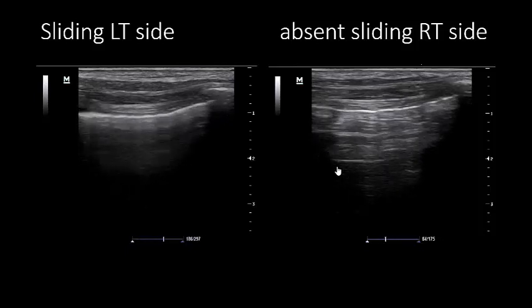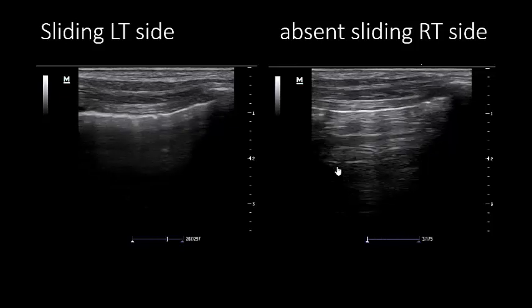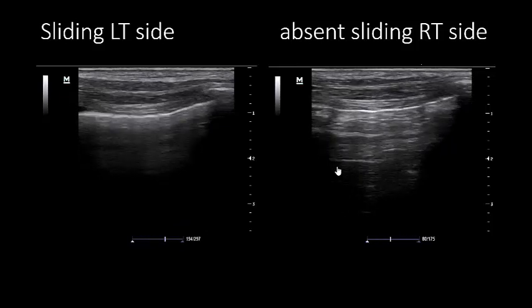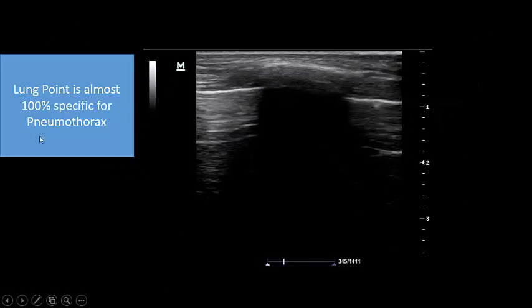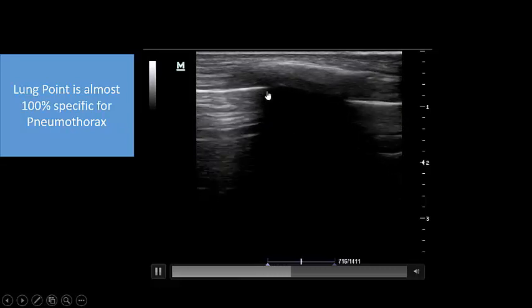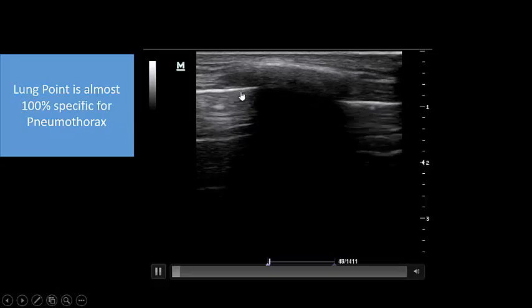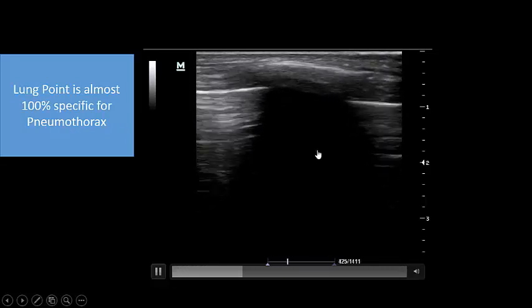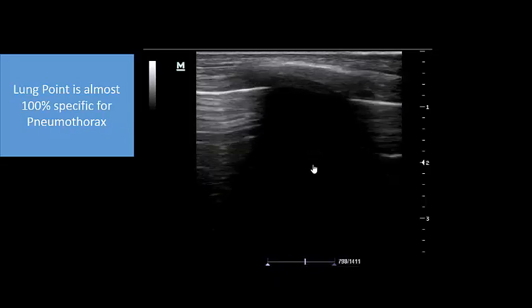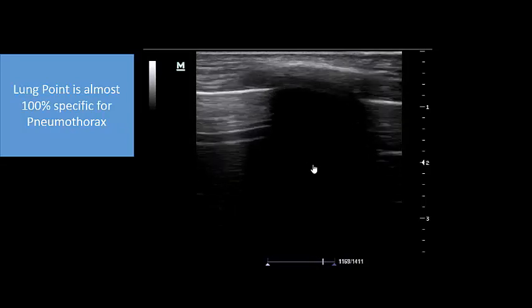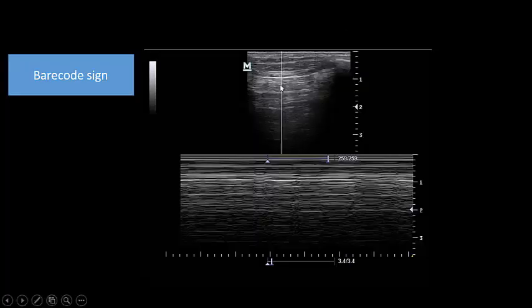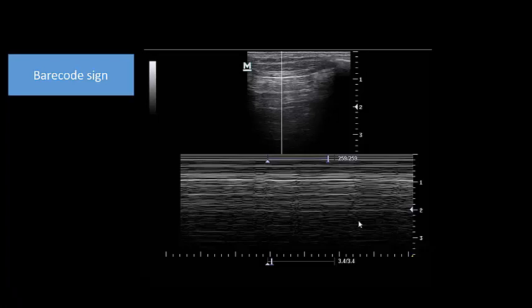What is specific for pneumothorax is the lung point. Here you can see this is the rib, rib shadow, and the pleural line — no sliding here, but sliding here. Sliding, no sliding, sliding, no sliding — this is the lung point, which is almost 100% specific for pneumothorax. We also have the barcode sign on the right side: everything is static, no movement of the lung at all because of the pneumothorax, appearing as a barcode in M-mode. So: absent sliding, lung point, and barcode sign — the patient has a right-sided pneumothorax.